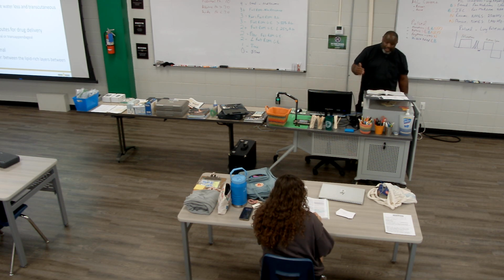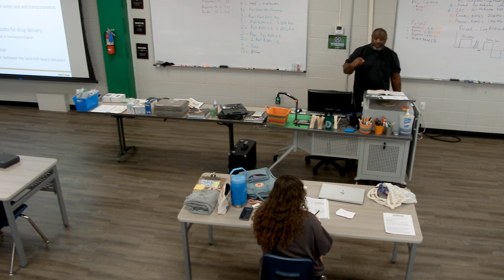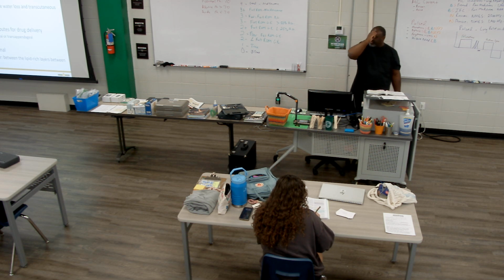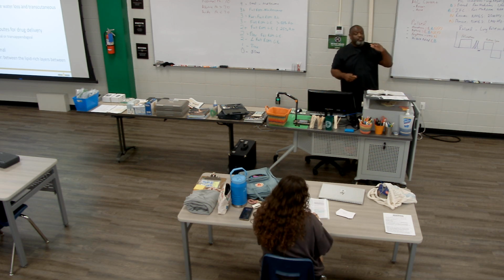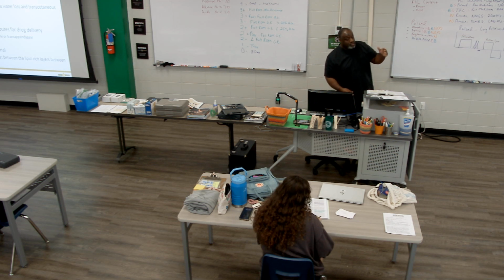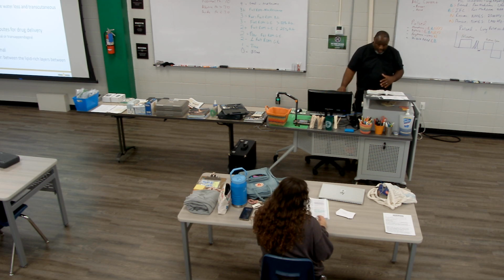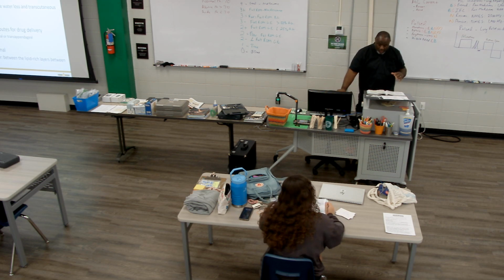It's a cation, meaning it has a positive charge. So lidocaine comes with a positive charge. If we want to get lidocaine, which is good for numbness or good for pain, into the body in a certain area, we would use a positive electrode or the anode over that area, and we would have like charges repelling.